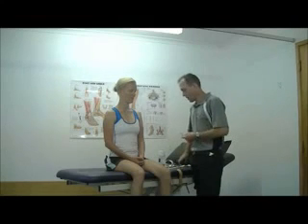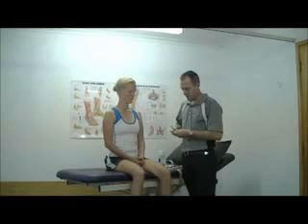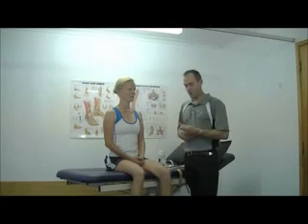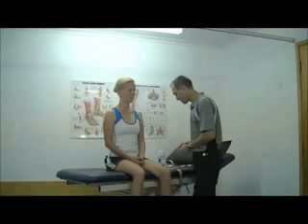It's also important to try and reduce the risk of curling or lifting or peeling of the ends by just rounding the corners. You'll find that with all of your tapes, Fixomull, Kinesio, any of those tapes, if you round the corners, you're far more likely to reduce the risk of peeling and get a longer lasting taping application.